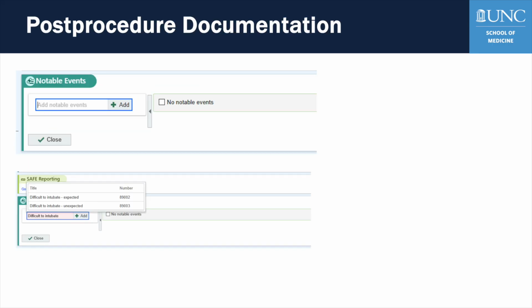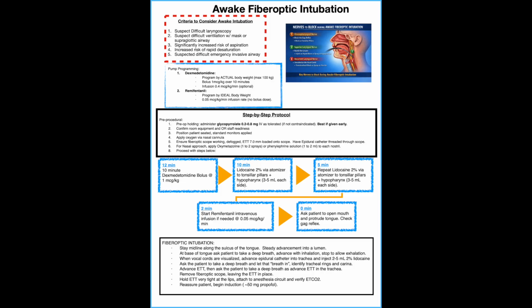After the case, document awake fiberoptic intubation as a notable event in the electronic record, including any challenges encountered and the strategies used. This supports quality improvement and future airway planning for the patient.